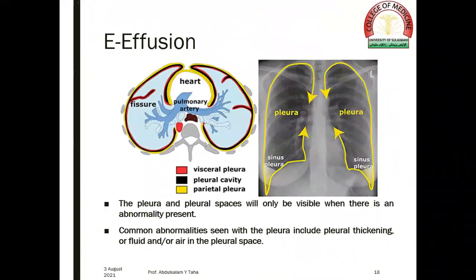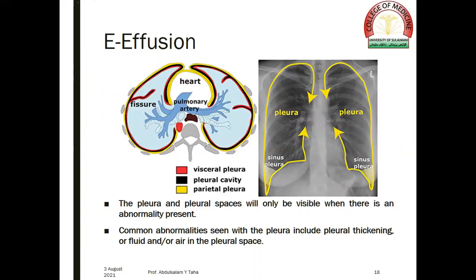Effusions — pleural effusions. Normally the pleura and pleural spaces will only be visible when there is an abnormality present. Common abnormalities seen with the pleura include pleural thickening or the presence of fluid and/or air in the pleural space. The pleural space is a potential space, and it is very important to notice the pleural sinus or pleural recess on the right side and on the left side.